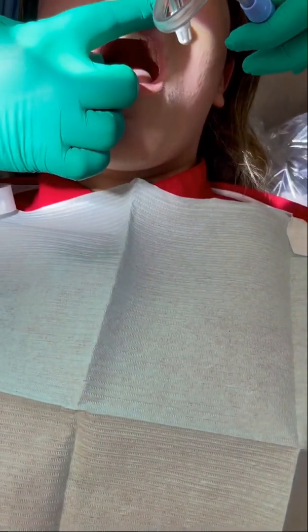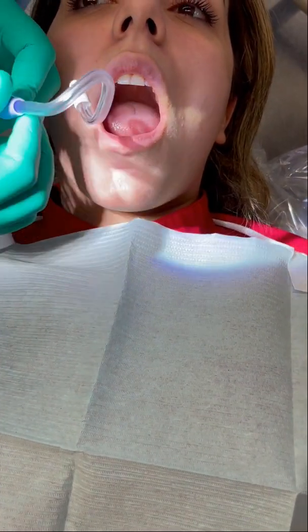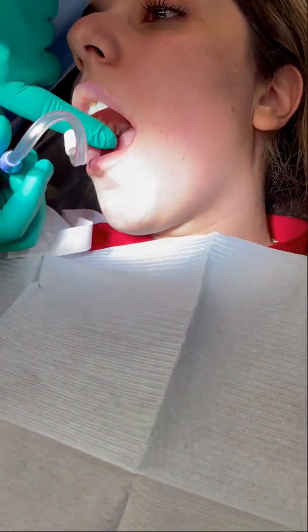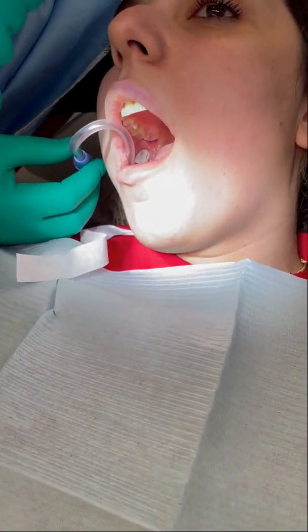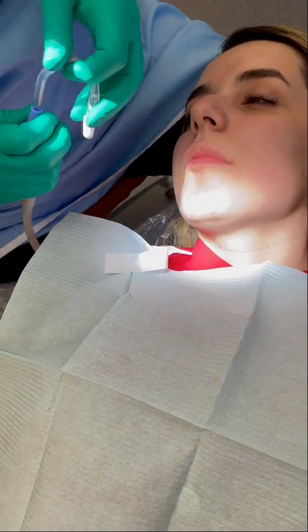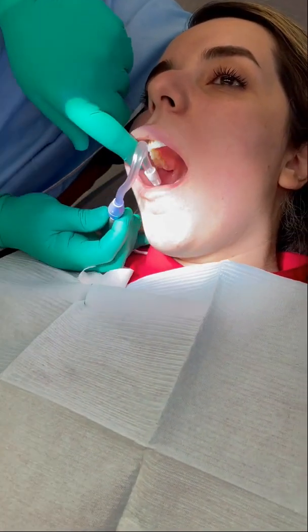My sequence is I go from here, to here, to here, to here — kind of like x-rays. And then you don't need to adjust it. All you have to do is have your patient turn to the right, and it's all set to go for the upper. And then one more bend for the lower when it's tight, and just bend it back where it goes.